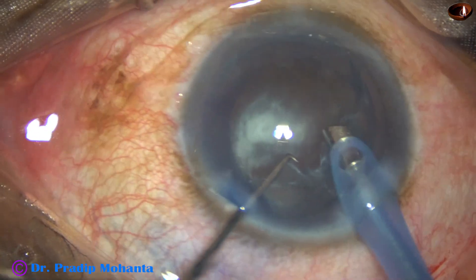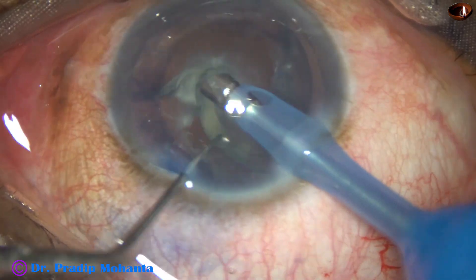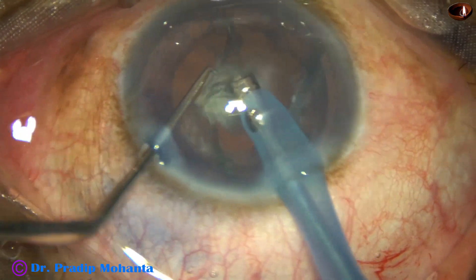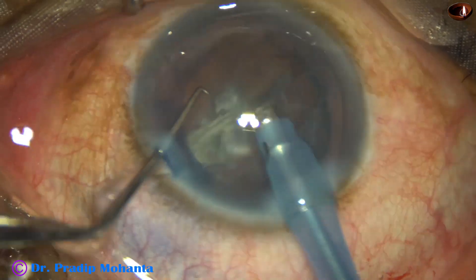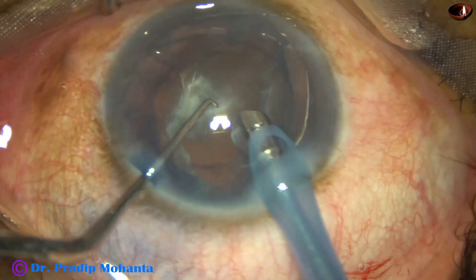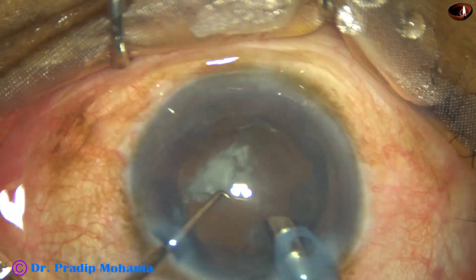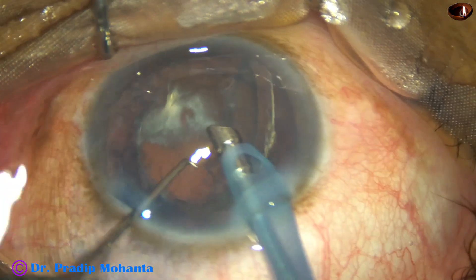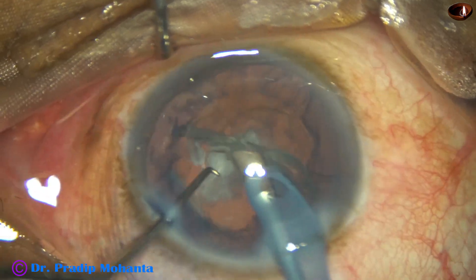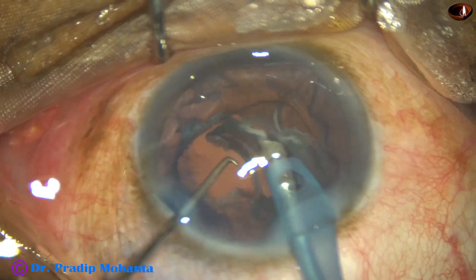The epinuclear shell is being very gently mobilized. I find that the posterior subcapsular or posterior polar cataract has gently separated from the posterior capsule, and posterior capsule rupture has not occurred.